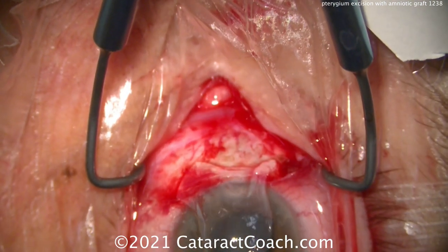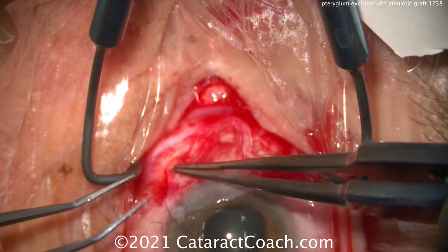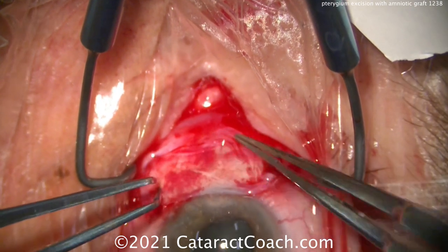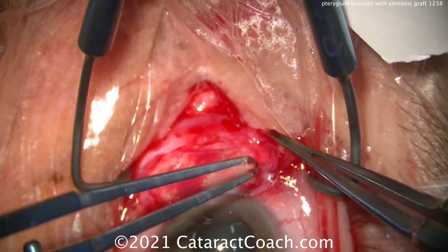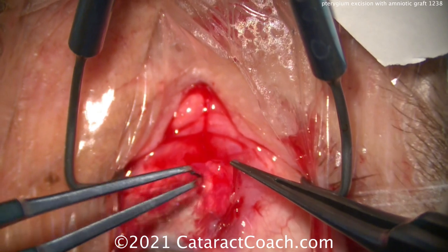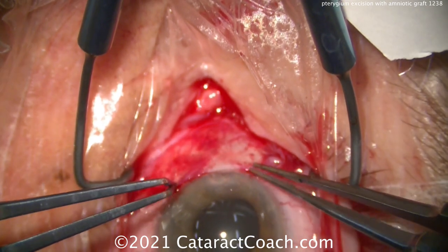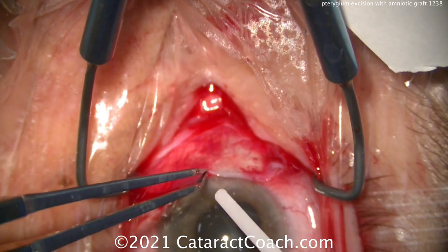Here's the amniotic graft placed on the cornea, and we'll open it up and get it into position just where we want it. That looks great — remember to keep the correct orientation. We can tuck this underneath that conjunctival pocket that we made, and then we can use these forceps to really smooth it out. The patient has not had a retrobulbar block — in fact, I'm asking the patient to look in different directions and he's able to do it very easily. So I'll pull that right up to the limbus, and now we're ready for the tissue glue.